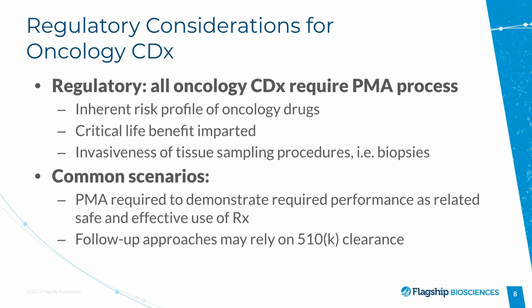Follow-on approaches, further refinement of an approved companion diagnostic, can rely on a less stringent regulatory approval pathway, such as 510(k) clearance, where the originally approved CDx serves as a predicate or a reference IVD test. Thank you, Susanna. Mike, did you have anything to add here? No, I think actually Susanna covered it very well.